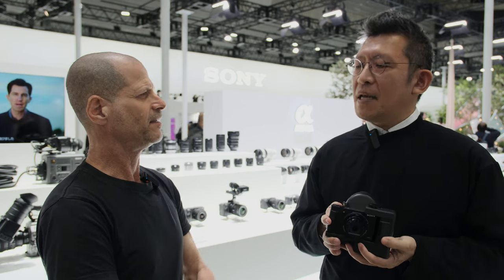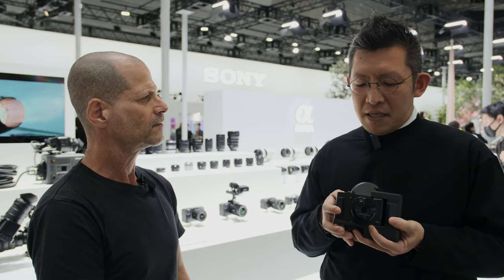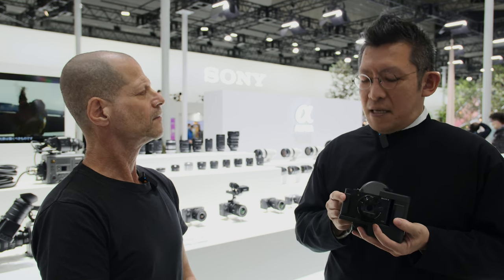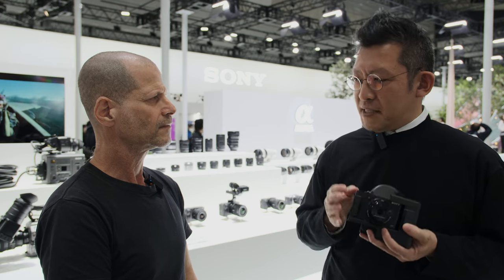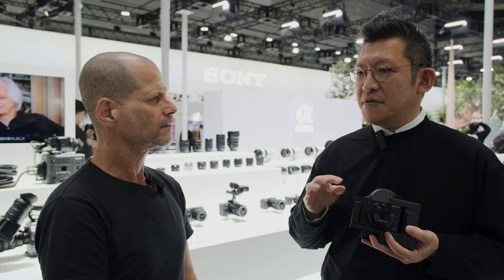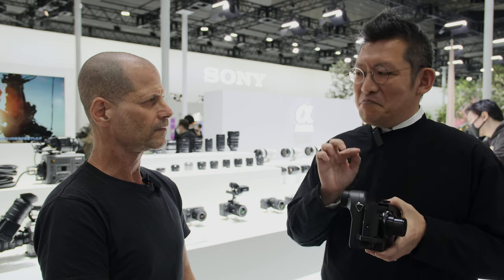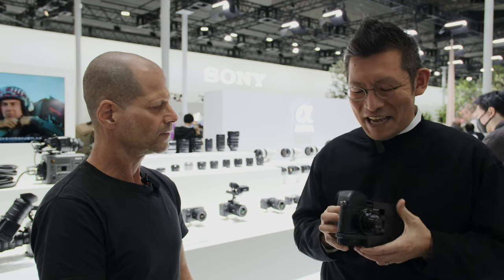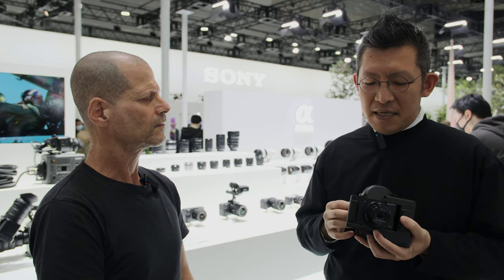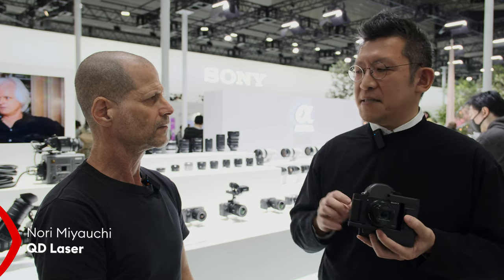How about pricing and availability? We will sell the device with this combination and the market price will be around $1,000 USD. The camera itself costs around $800, and actually the device alone is much more expensive than that. However, Sony provided huge support on this project, so you can buy the full bundle for around $1,000 USD.